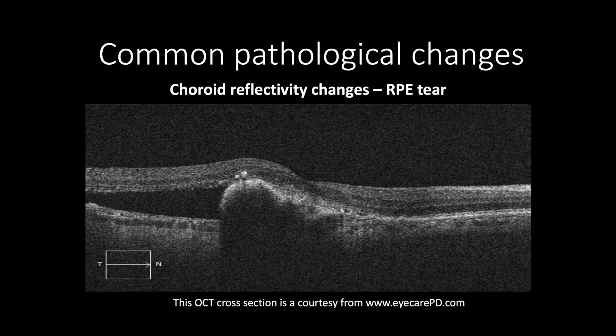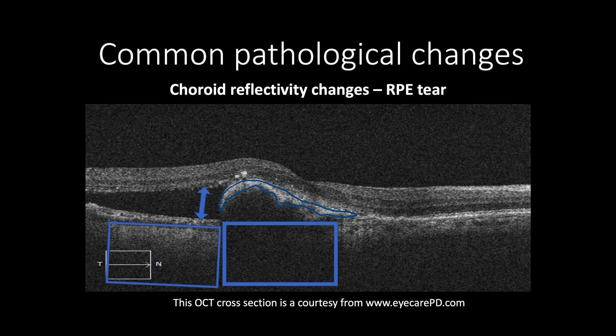However, contraction of RPE in cases of RPE tear, which appears as increased reflectivity causing indentation of the retina, may cause hyporeflectivity of the choroid due to shadow artifact, and increased reflectivity of the adjacent area of the choroid due to absence of RPE in the area where RPE was ripped off.